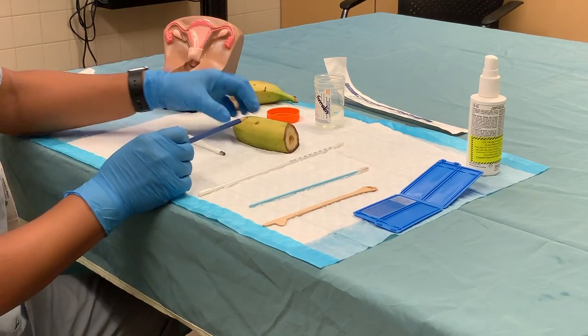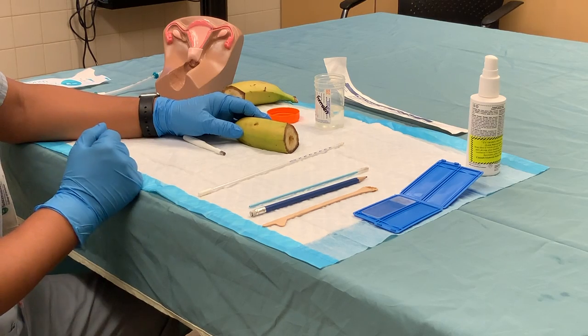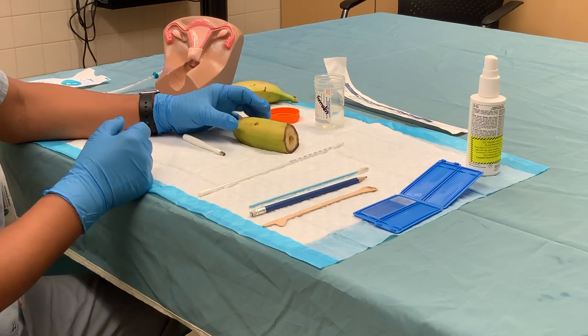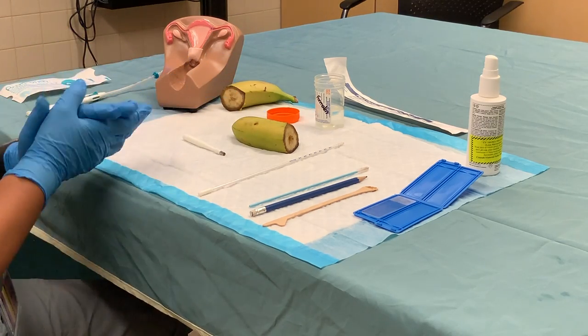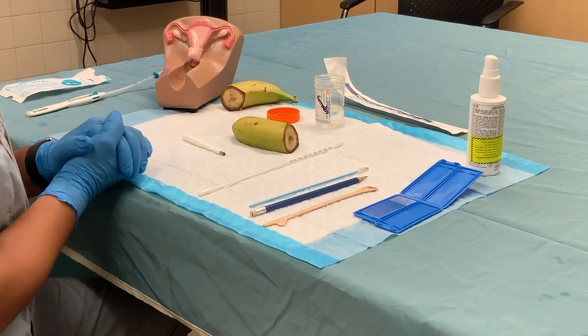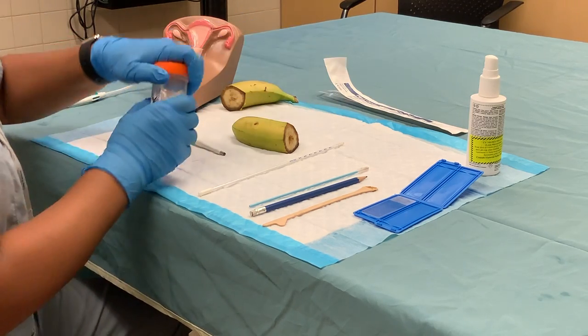Sometimes the tissue can be left in the bed of the vulva. In that case, use iris scissors and tooth pickups to obtain the sample, then send it in a jar with formalin for pathology.